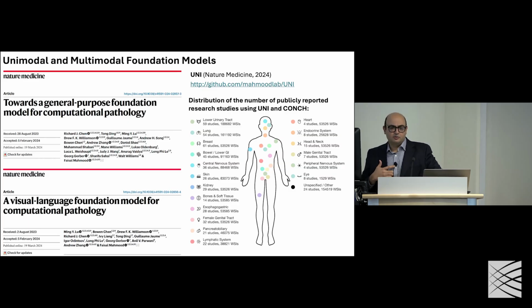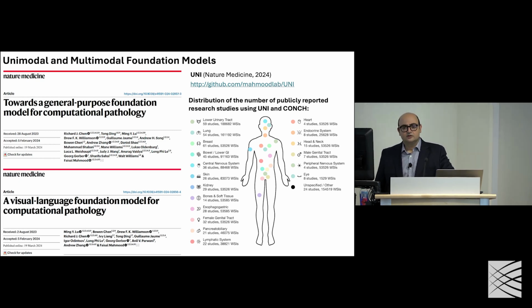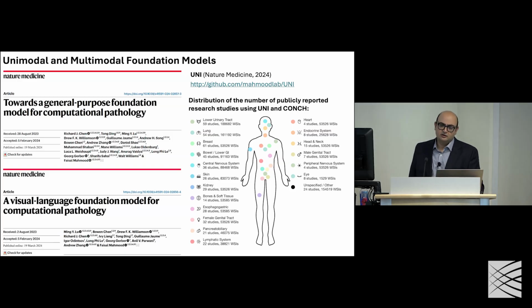And then there are also synoptic reports. We didn't look at synoptic reports. We just looked at the descriptive reports, embedded them, and looked at them in feature space. That was one way. But we also looked at how diverse it is just by looking at the diagnosis. And then there was some existing data that we had collected in the past for other projects that was also used. In many cases, some of the data we were collecting was very diverse to begin with, because we're dealing with rare disease and other kinds of indications.